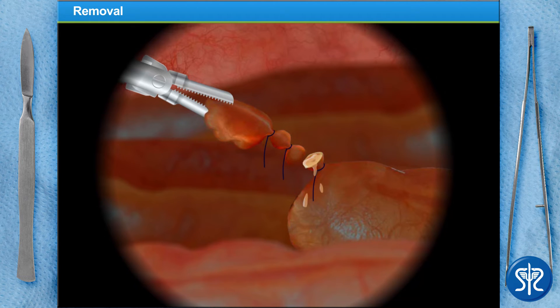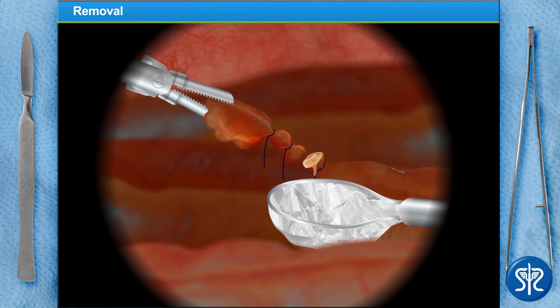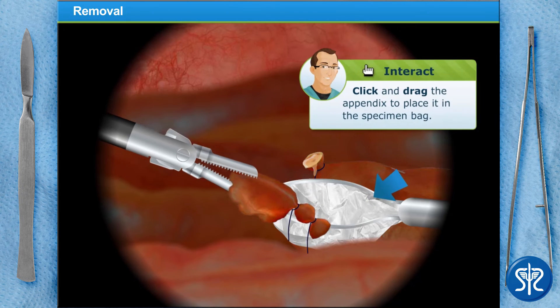To remove the appendix from the abdomen, place it into the specimen bag and pull it out through the trocar.